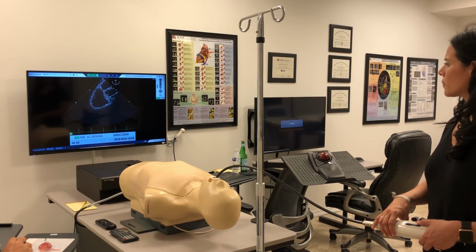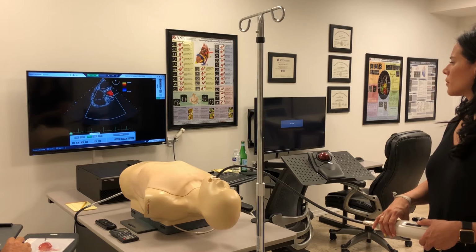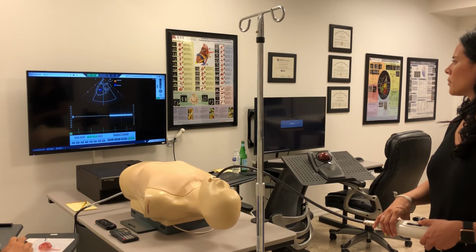This is a good color shot of the tricuspid valve. There's the E and A wave, and it's also a good Doppler shot. Here's a PW Doppler with E and A wave of the tricuspid valve.